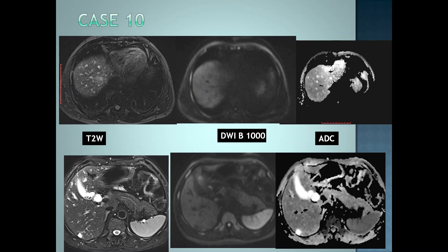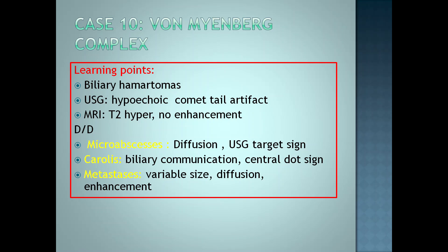The 10th case: these are T2-weighted images, diffusion B1000 images, and ADC maps. We see in the top and bottom panel portions there are multiple T2 hyperintense small lesions in the liver which do not show any diffusion restriction. The 3D MRCP image shows multiple well-defined T2 hyperintense lesions with no biliary communication, all measuring 5–6 mm or less. The diagnosis is von Meyenburg complexes, also known as biliary hamartomas. On ultrasound, these are characterized by hypoechoic lesions with comet-tail artifact. On MRI, there will be T2 hyperintensity, no enhancement, and no diffusion restriction. Caroli disease is differentiated on MRCP because there will be biliary communication and a central dot sign on T2-weighted images.